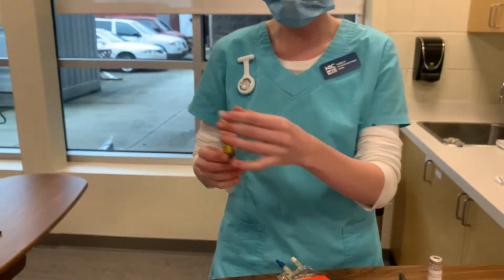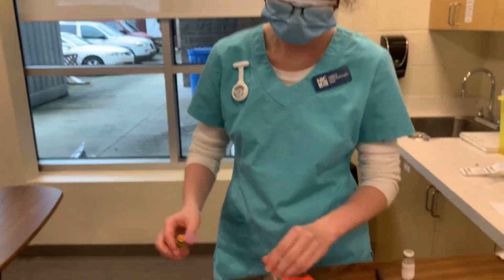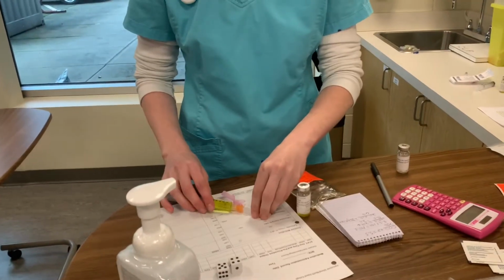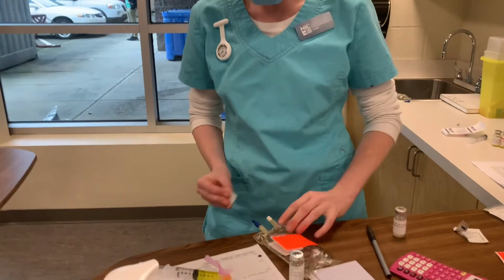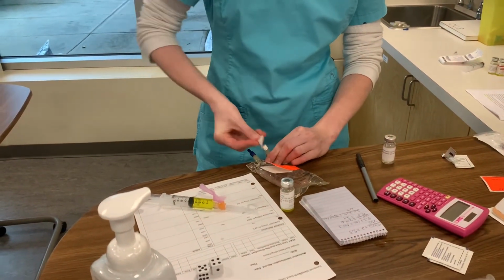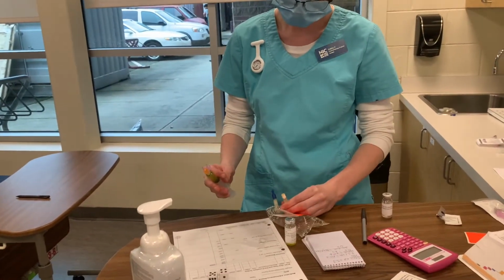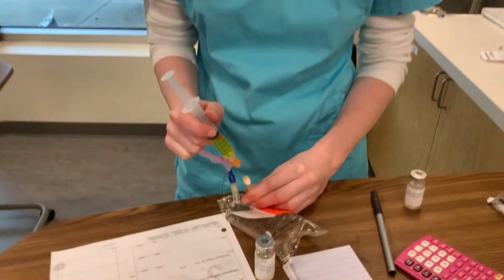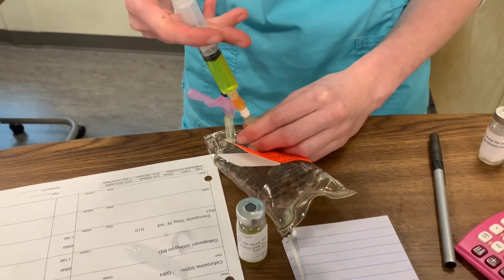Now I remove the safety feature, remove the cap. Just kidding, I forgot to sanitize the little part, but that's okay, as long as I hadn't done it yet. And now as it's drying, and now that it's dry, I inject it carefully, straight, not to puncture the bag.